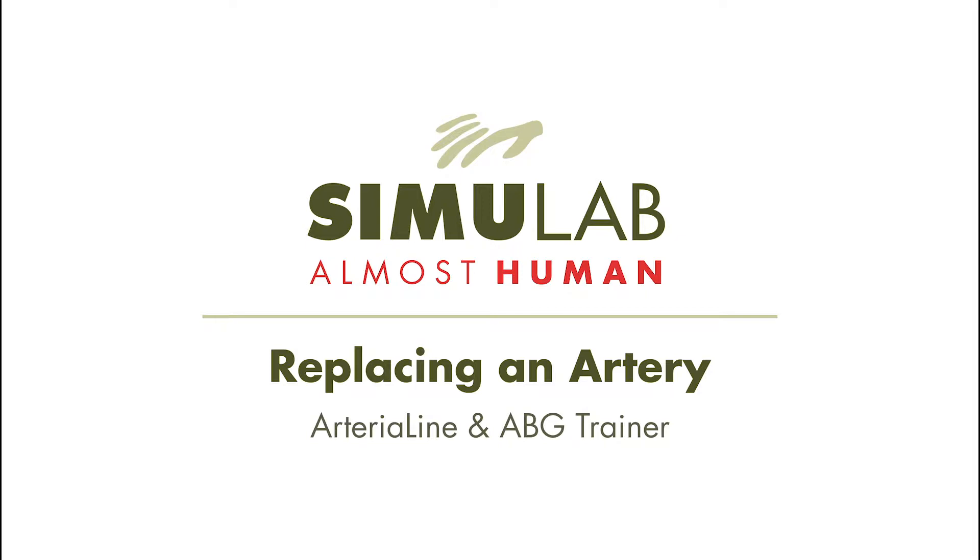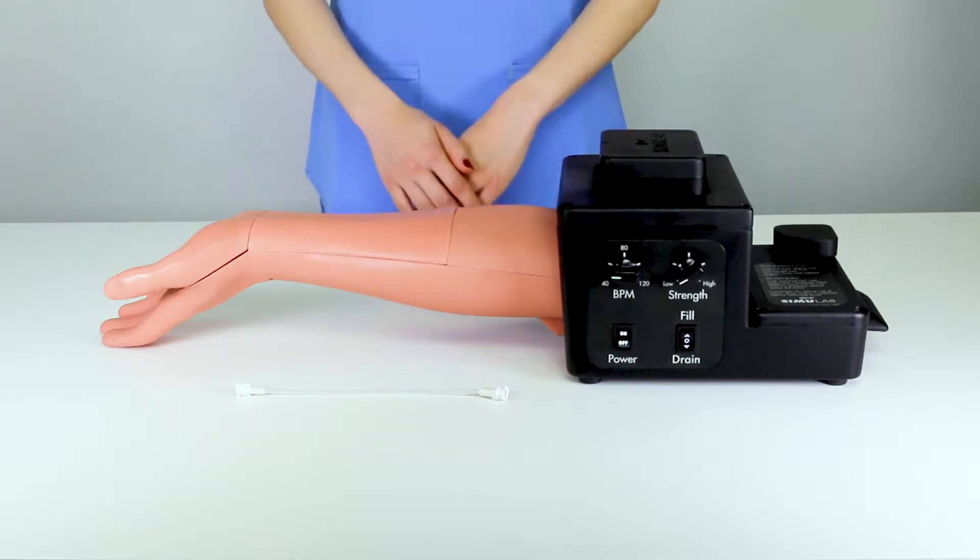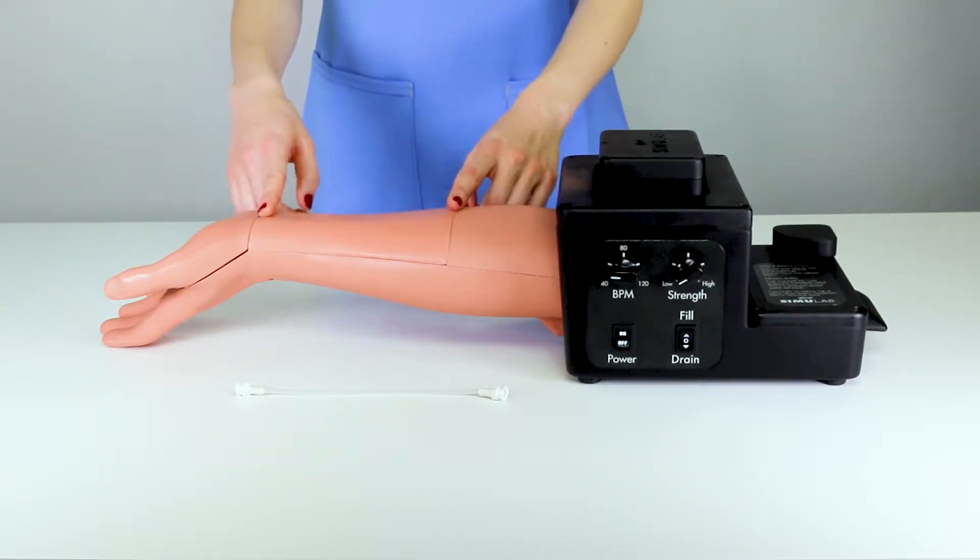Replace an artery on the Simulab arterial line and ABG trainer. To replace an artery, it is best practice to first completely drain the fluid line.